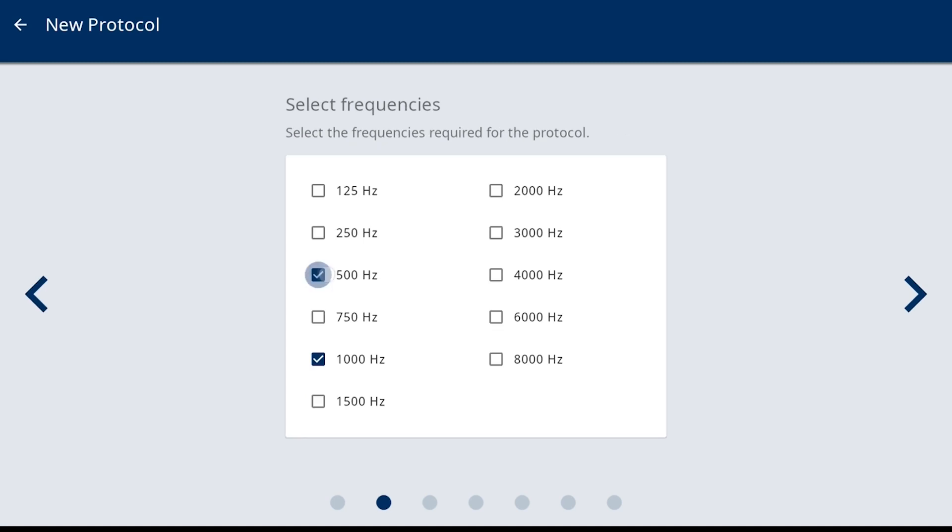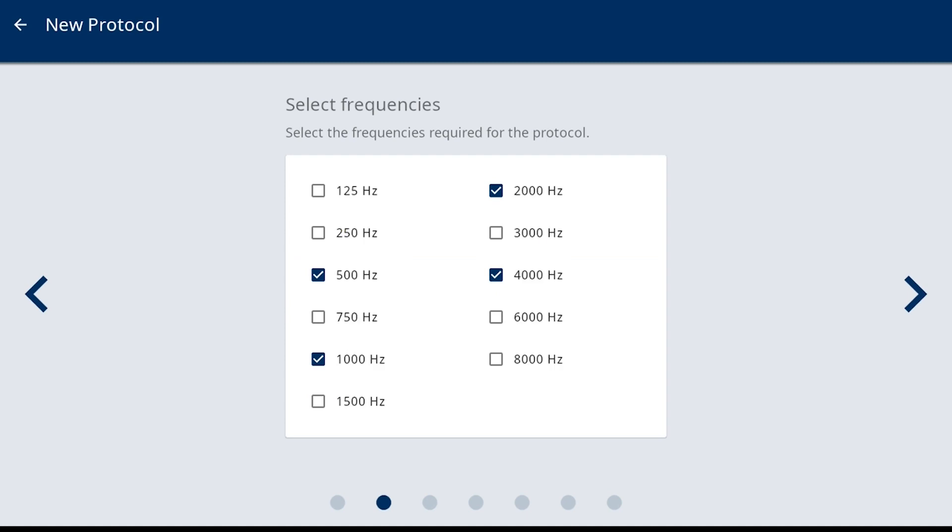Selection of test frequencies is next. Select the frequencies that are required for your hearing screening program. The blue check mark indicates those frequencies activated and part of the protocol.